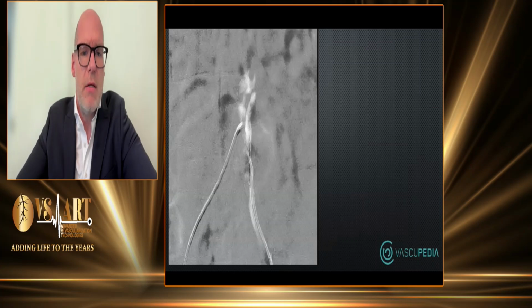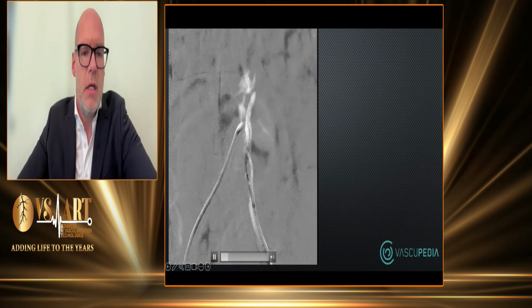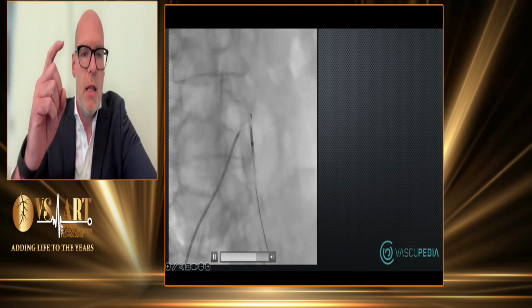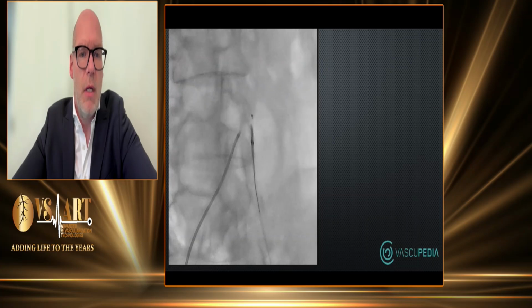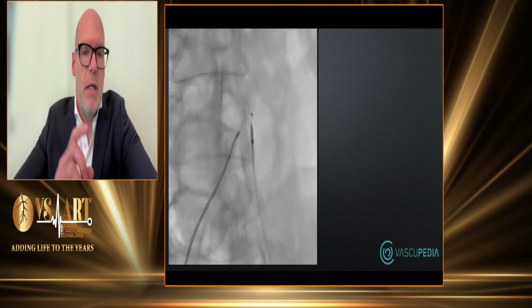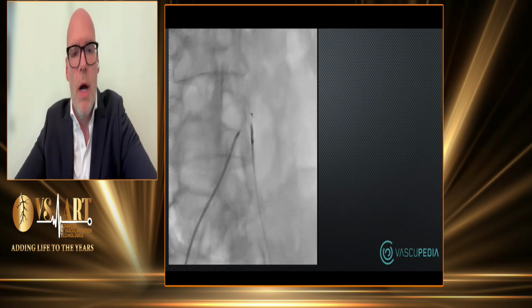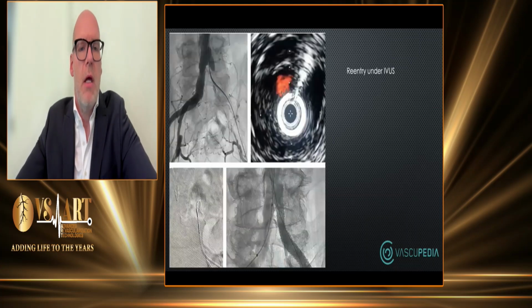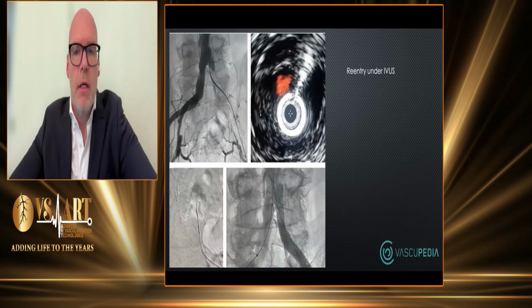You see on the one side a small crossing catheter, and on the other side also the system with the needle. Then we position it like a large L, and the needle is not very easy to see, and then the wire comes through the lumen. And after that, we can complete our treatment.